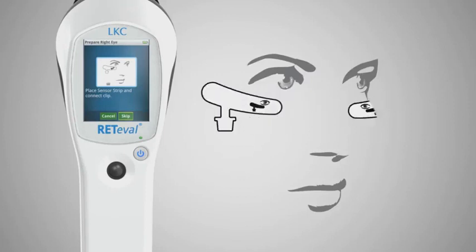Using the simple clip connector, attach the RETeval device to one of the sensor strips as shown by the graphic on the device display.